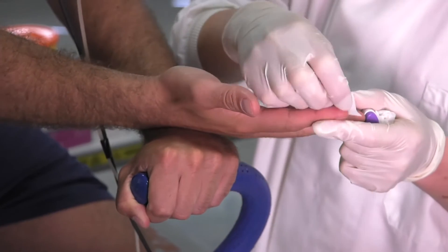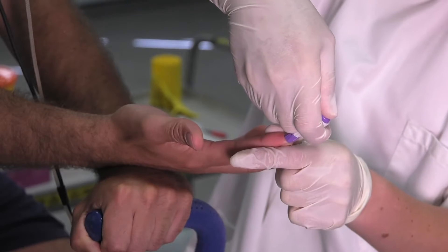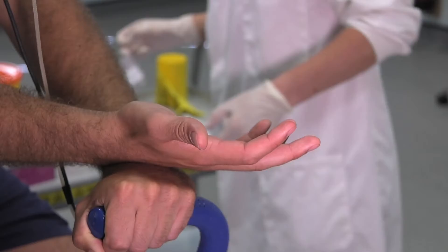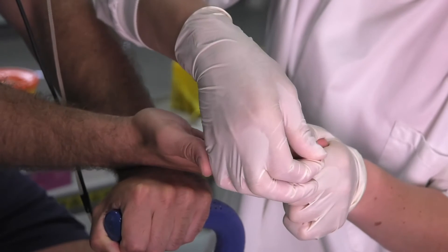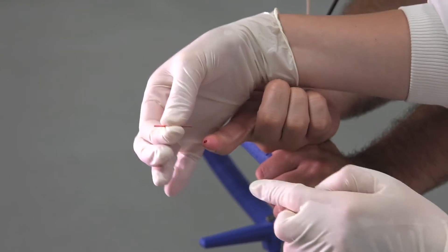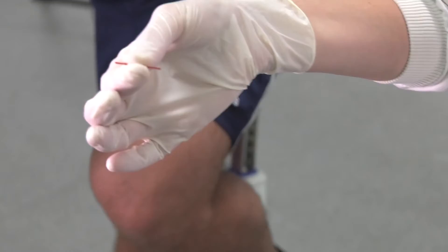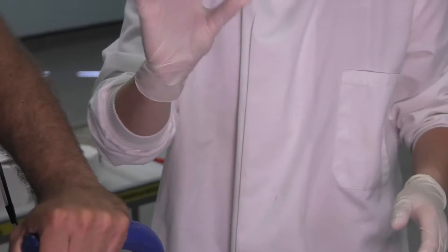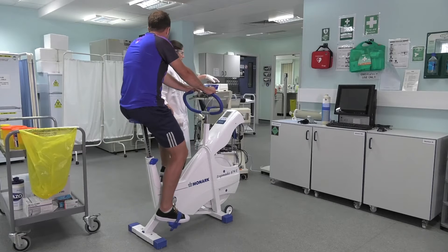The first thing is you're going to wipe the finger with an alcohol wipe. Then you prepare to get the lancet and push it down on the tip of the finger. Get your tissue and tube and push some blood, then wipe the first lot of blood away — this means you get rid of any lactate and any dirt. Then fill the tube with the blood, ensuring there are no bubbles in the tube. Then put the tube into the Eppendorf solution and shake it until it's mixed. This is now ready to be analysed.